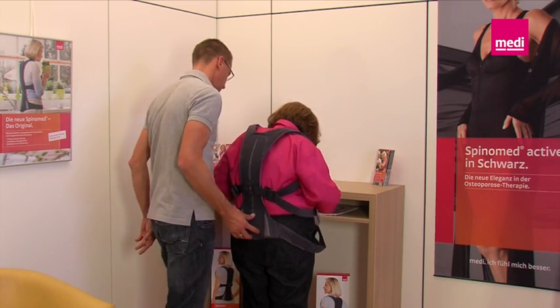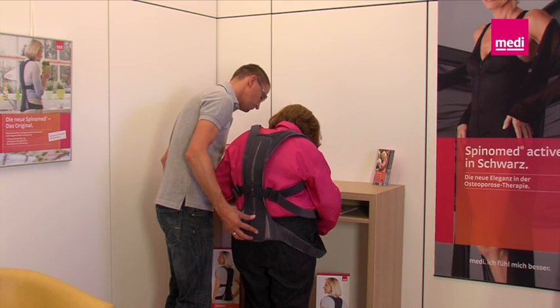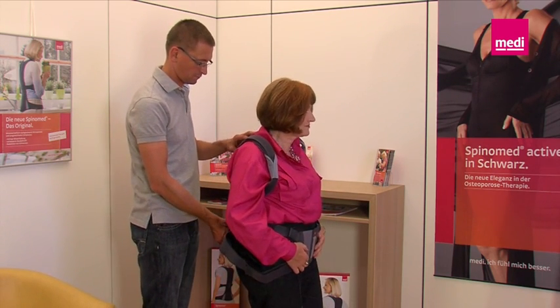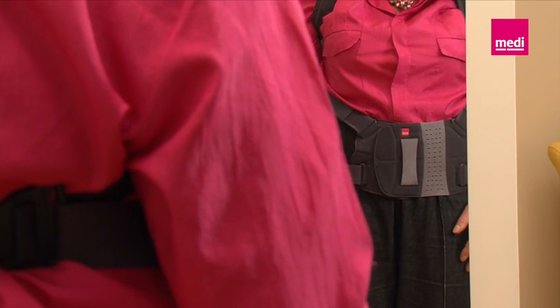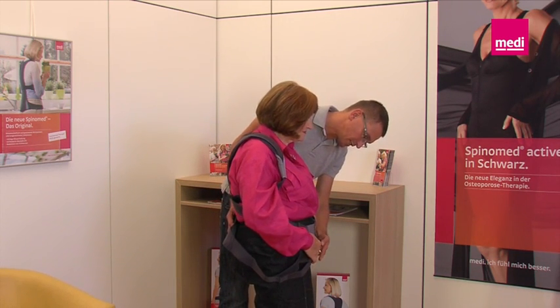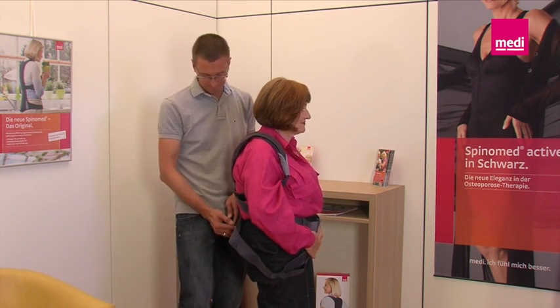Then the stomach pad can be closed. Make sure that the bottom edge of the pad is positioned on the pubic bone. The best way to do this is in front of a mirror, so the patient can memorize the correct position of the stomach pad. Now check again whether the front pad is positioned correctly. Ask the patient to help by holding the pad themselves with their hand at the level of the pubic bone.